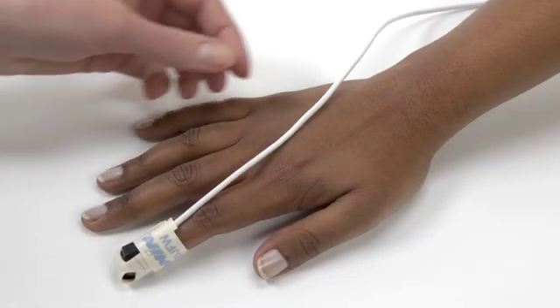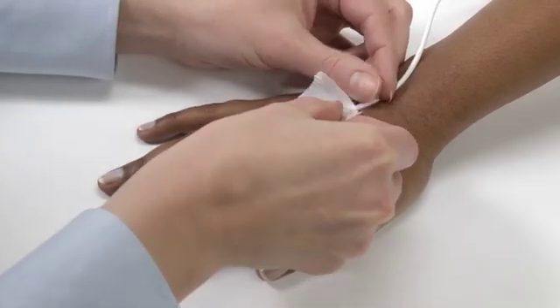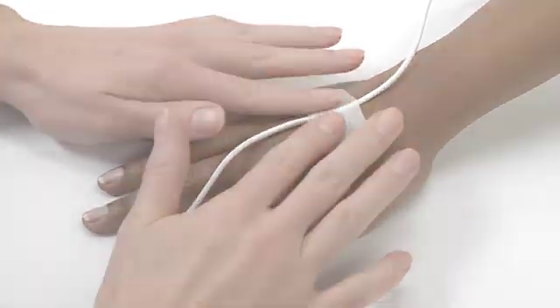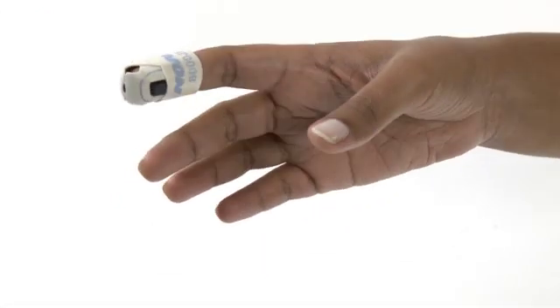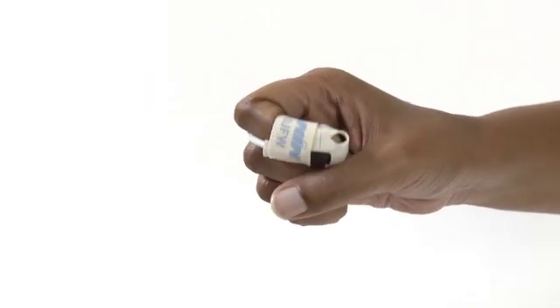It's a good idea to secure the cable with medical tape on the back of the hand with a little slack for movement. This helps prevent pulling at the sensor site. Don't wrap the sensor or finger tape too snugly. Tight wrapping can restrict blood flow and affect sensor accuracy.